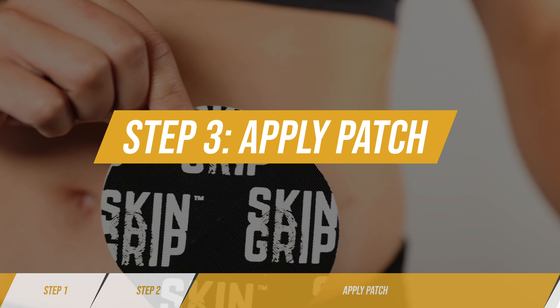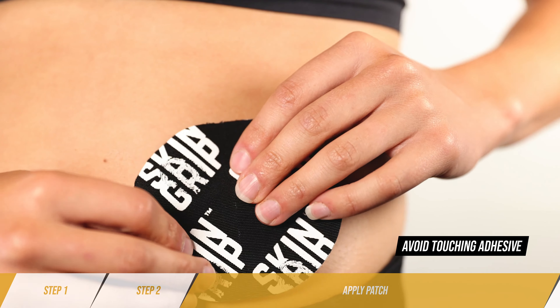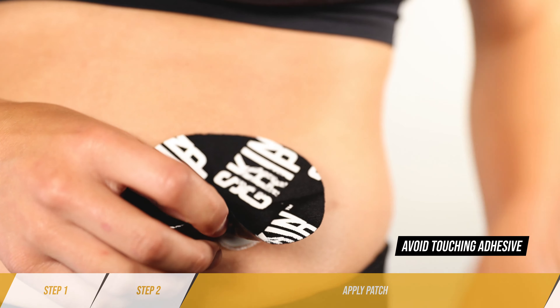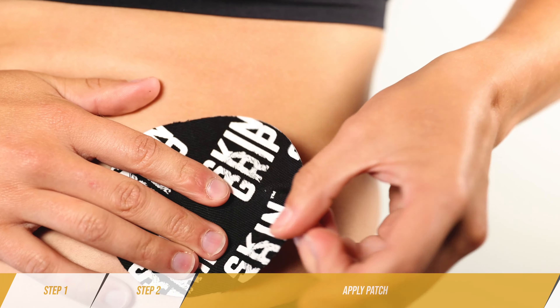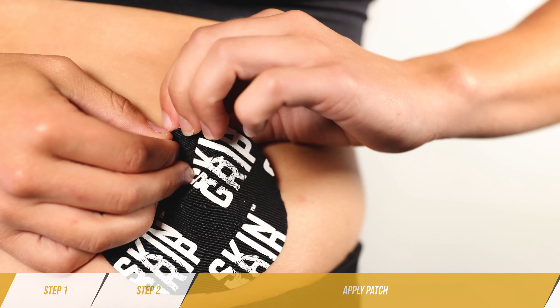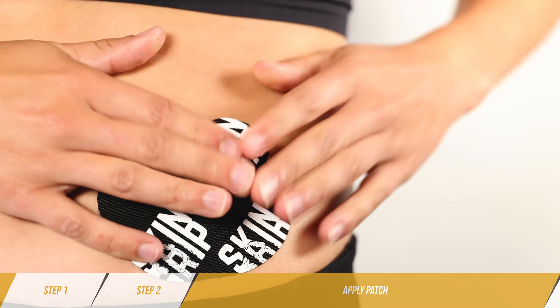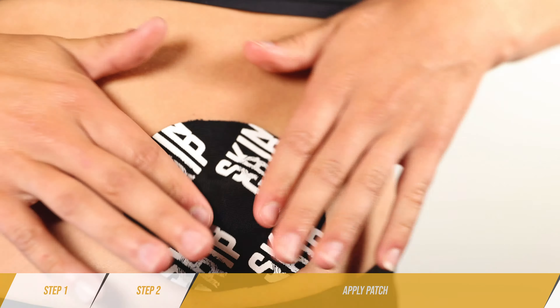Step 3: Apply Patch. Peel and place one tab at a time. Having trouble on your own? Get some help or apply in an easy to reach location. Firmly press the patch to the skin and remove any wrinkles. Wait one hour before activity.